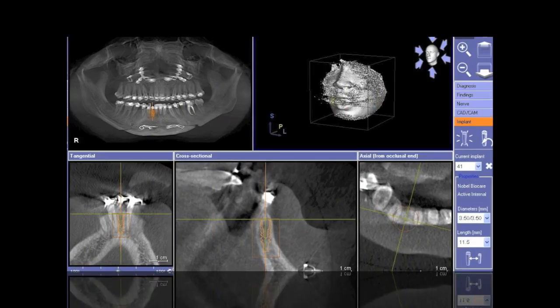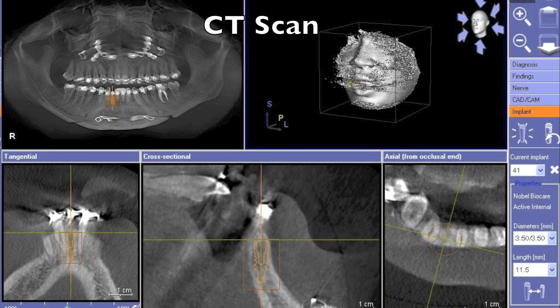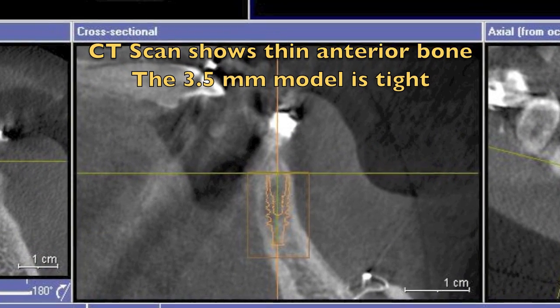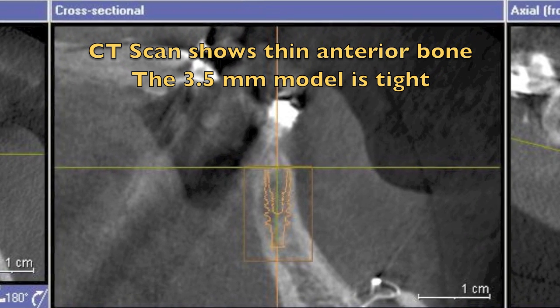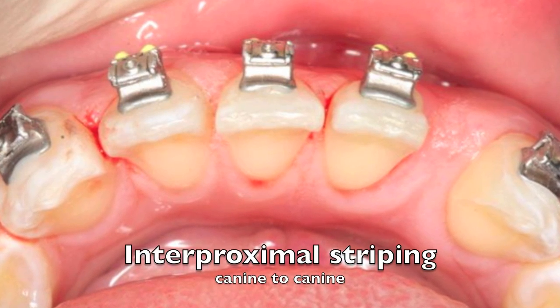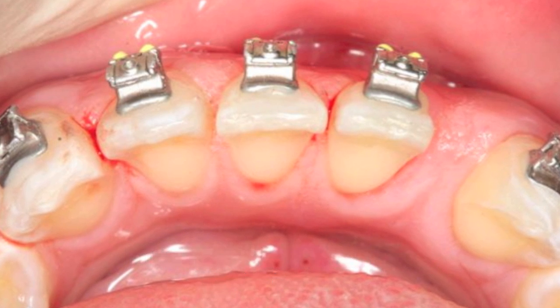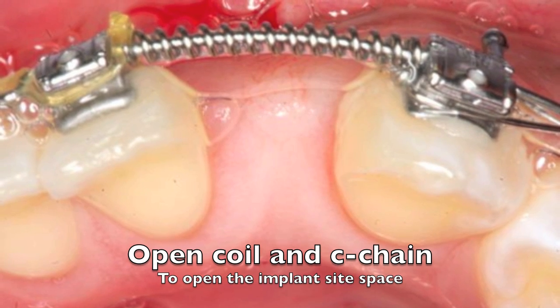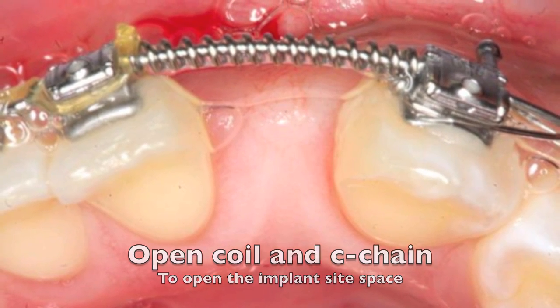We can also see from a buccal-lingual aspect on the cross-sectional view of a CT scan that there's not enough space — even a 3.5mm would be pushing it. So we decided we're going to use a 3.0 millimeter implant. But first we decided to do a little bit of orthodontics to get some space back. We did some interproximal stripping, some open coil and C-chain, which enabled us to get the space required to place the implant.